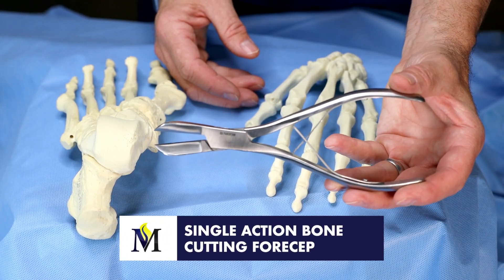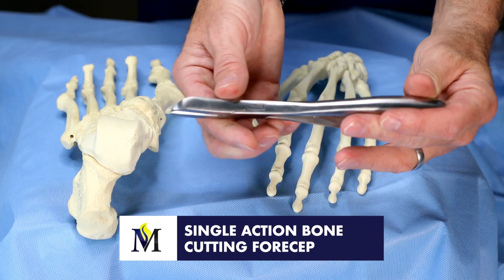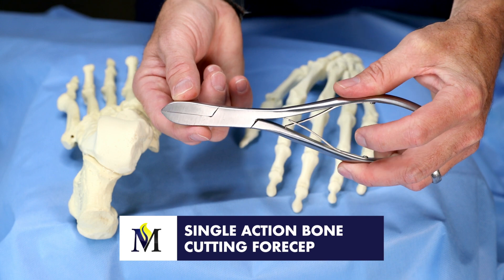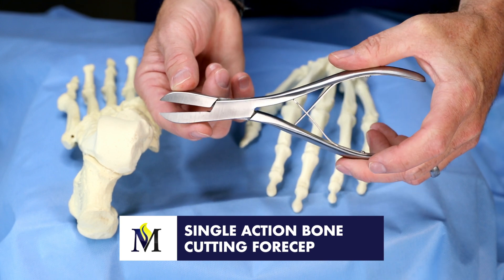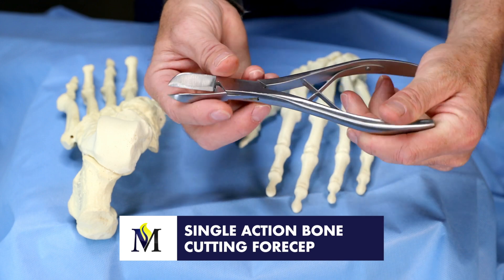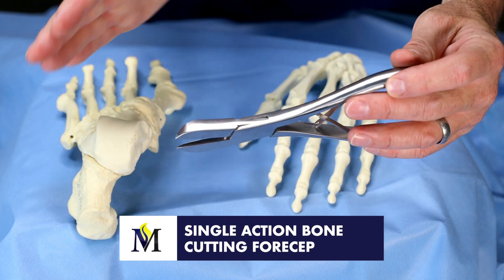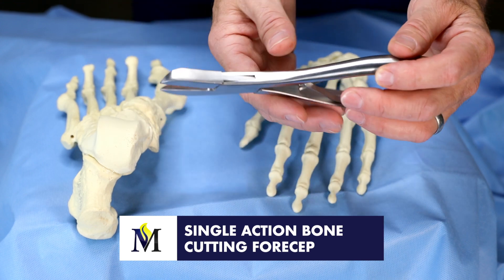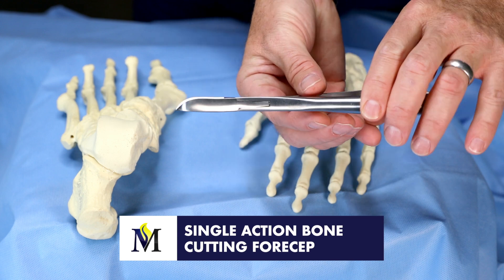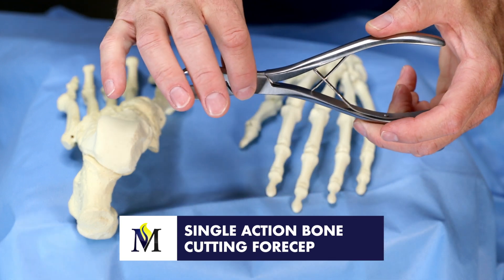This is a single action bone cutting forceps. It has a very aggressive working end whereby bone can actually be cut. The working end can be straight, as you see here, or can have a curvature to the end. It is single action in the fact that the middle of the bone cutting forceps is solid.